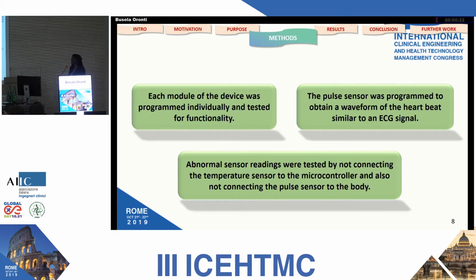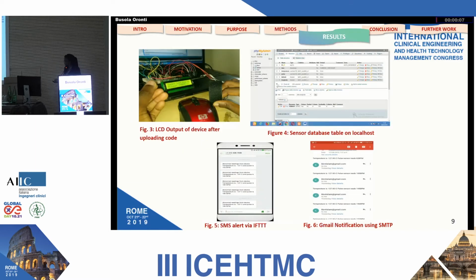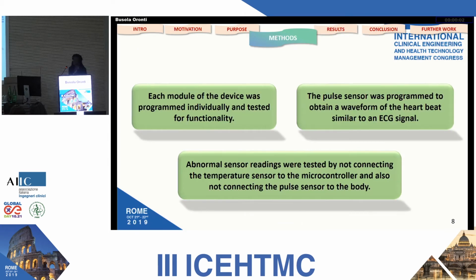Then in terms of abnormal sensor readings, because at that point in time we couldn't get anyone with abnormal sensor readings, what we did was disconnect the sensors from the microcontroller.